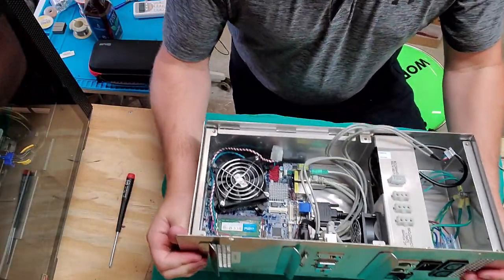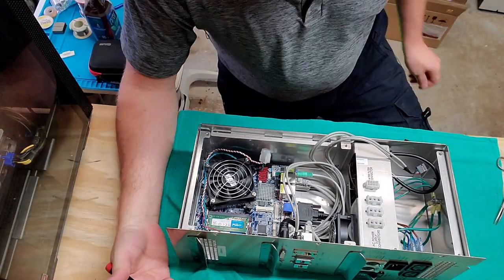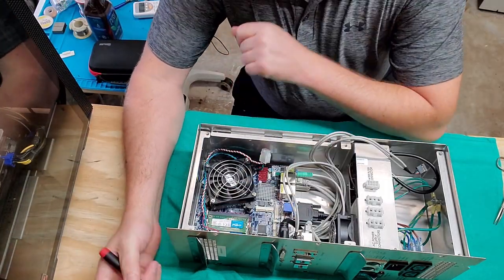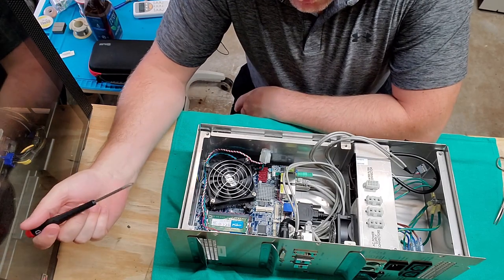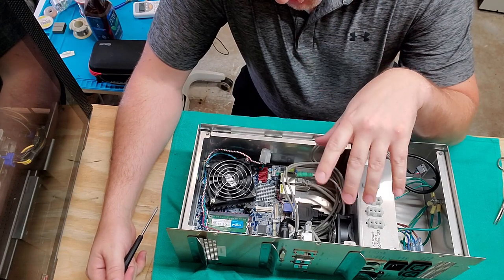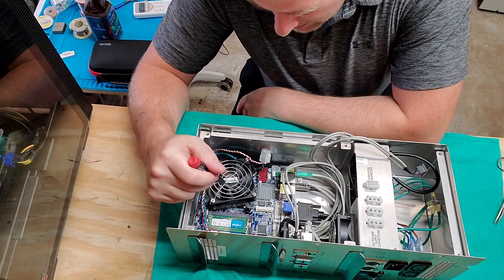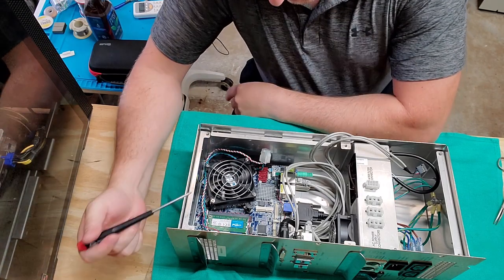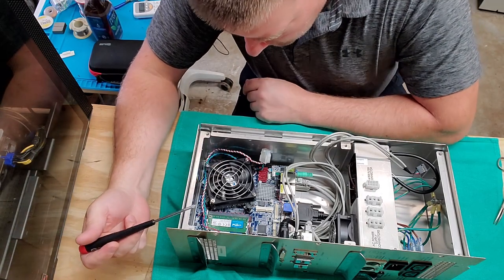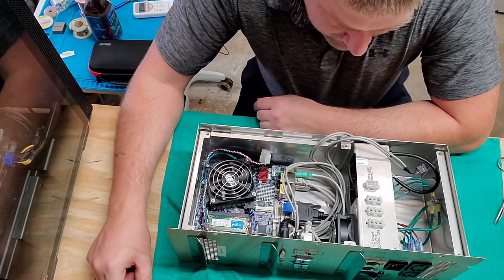So one of the things that they said is that this guy would have intermittent errors. So intermittent errors are usually caused by problems with either memory, which is right here. I got two memory modules. It could be attributed to heat. So if this guy is building up too much heat, it will lock up the CPU. And the bearings on the fan seem like they're good, but the fan does have a lot of debris on those fins. And the heatsink below it looks like it also has a lot of debris on the heatsink.